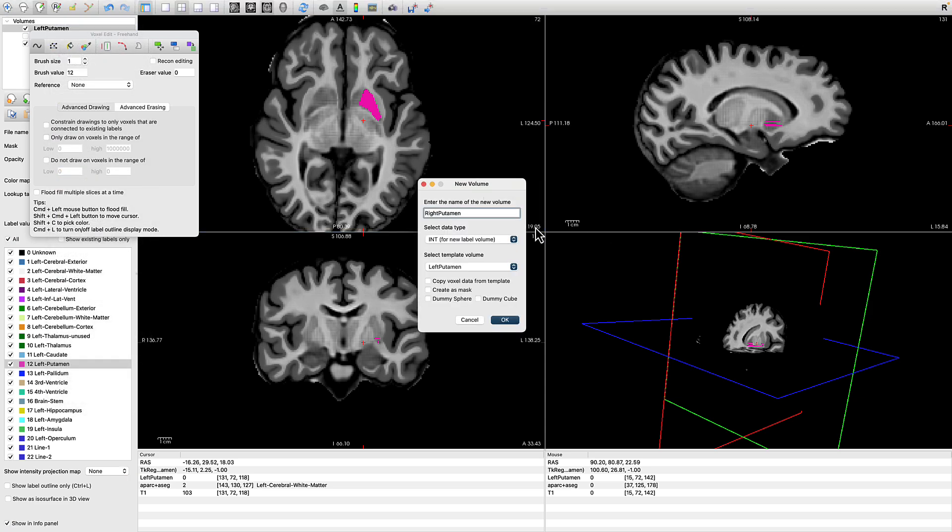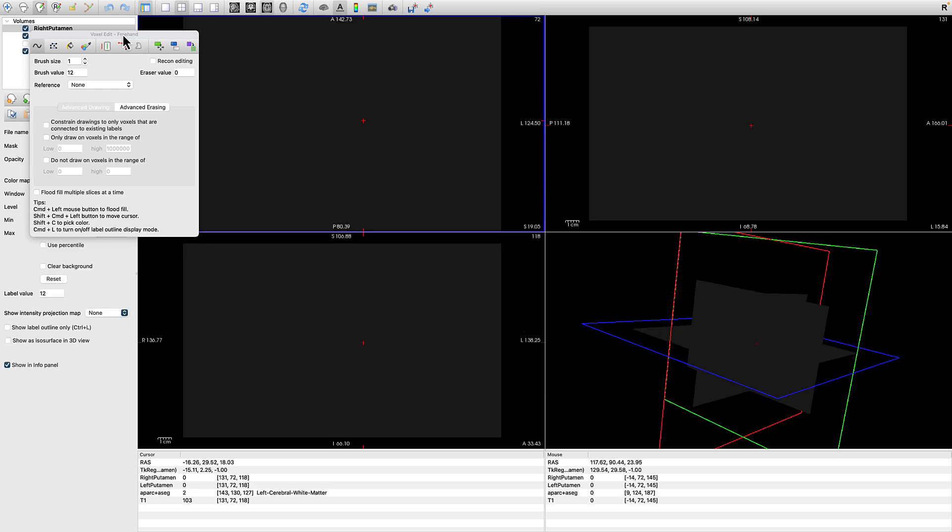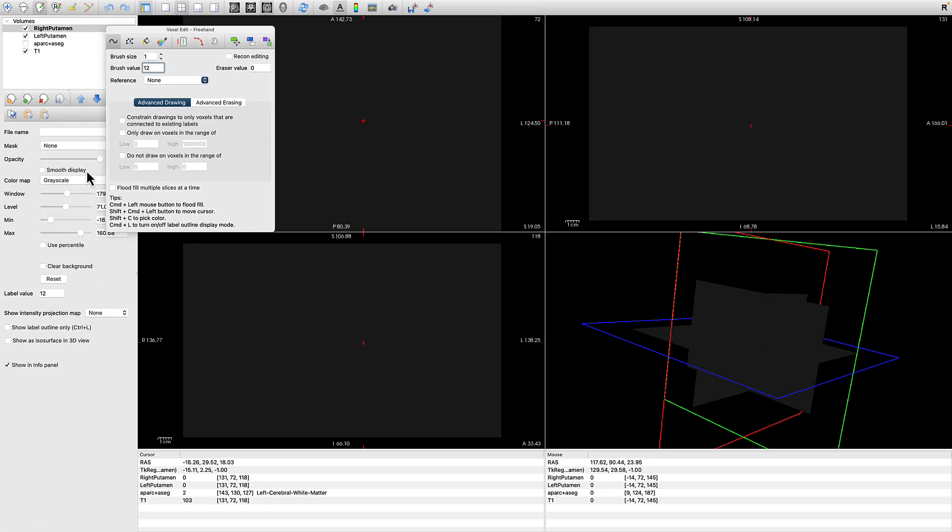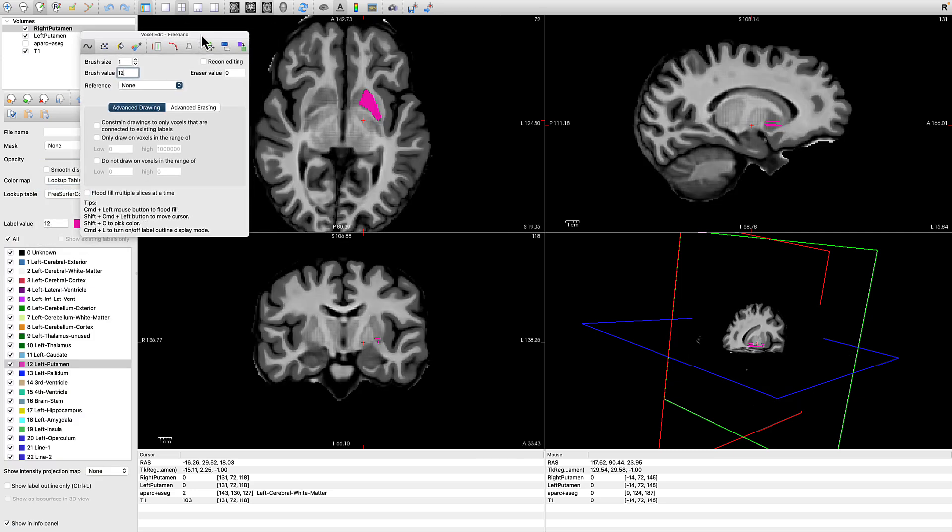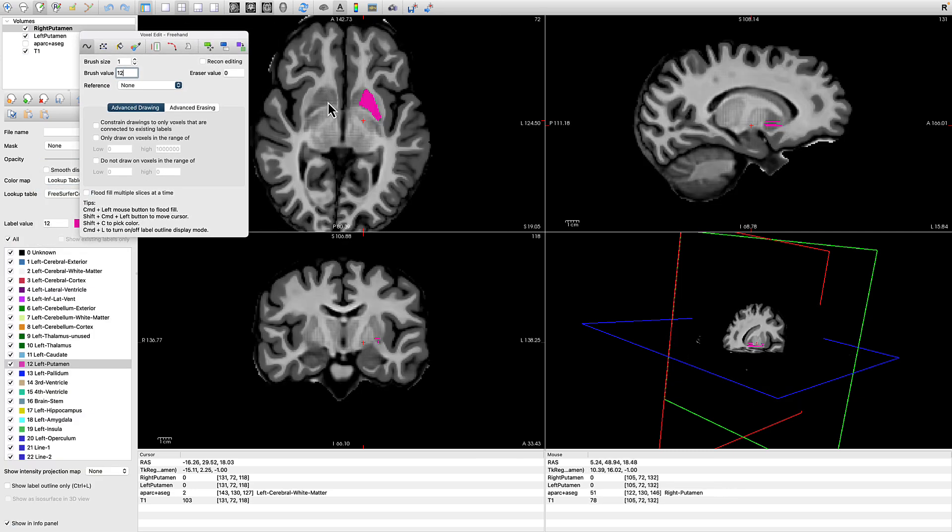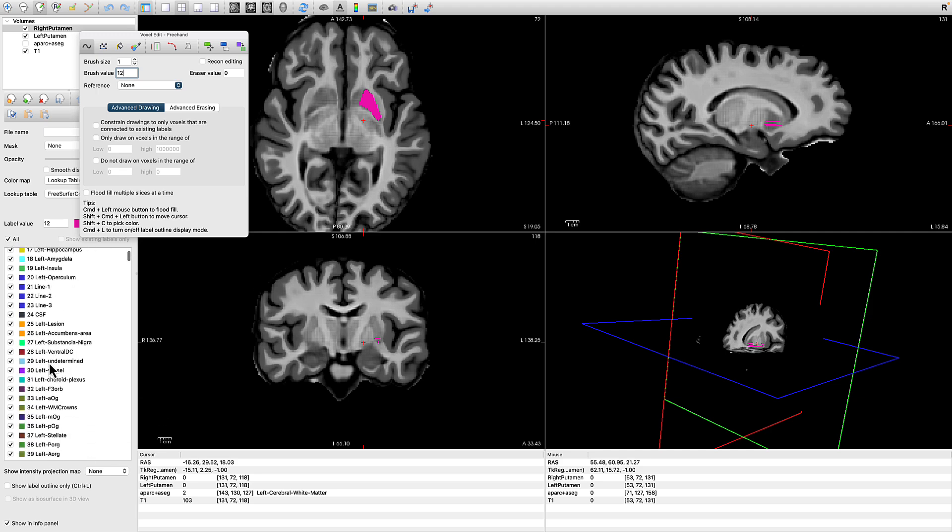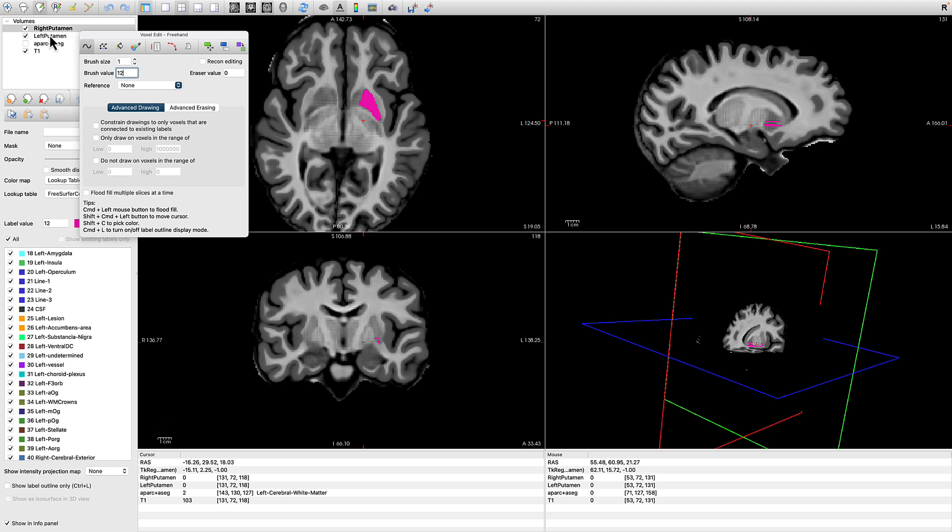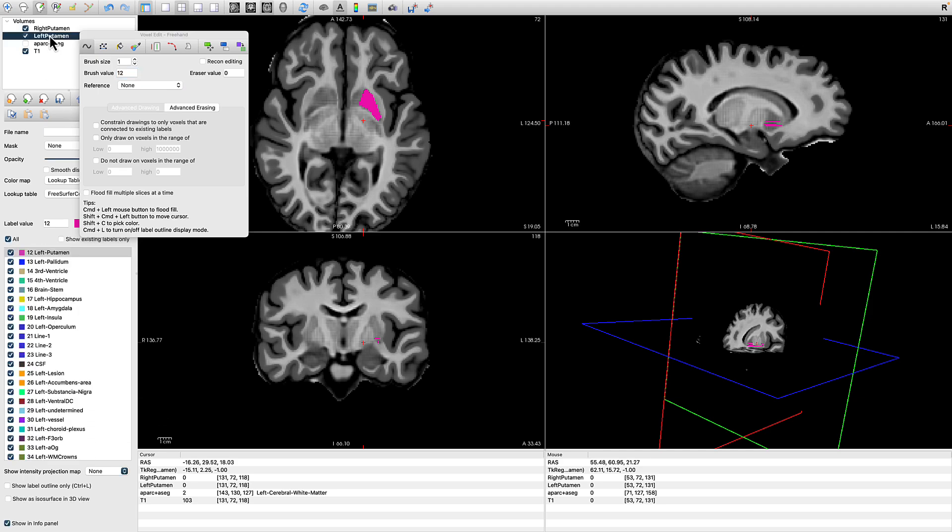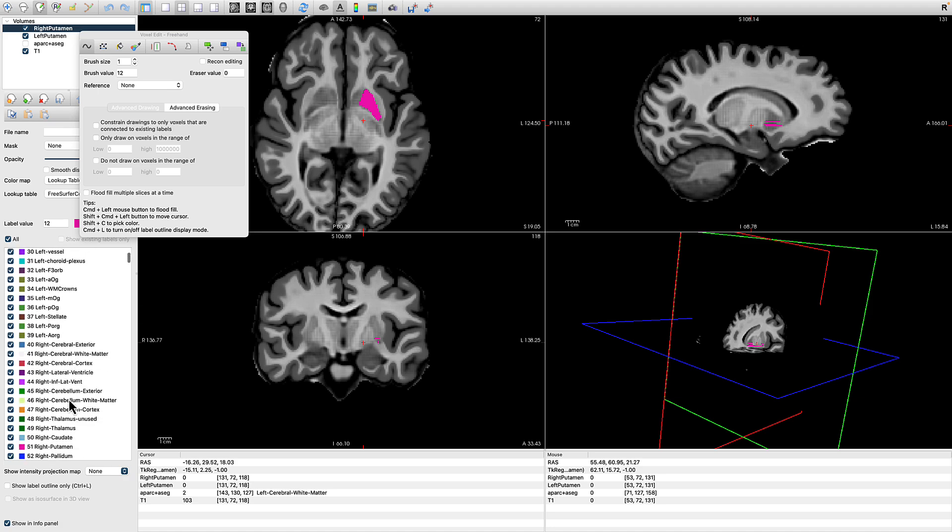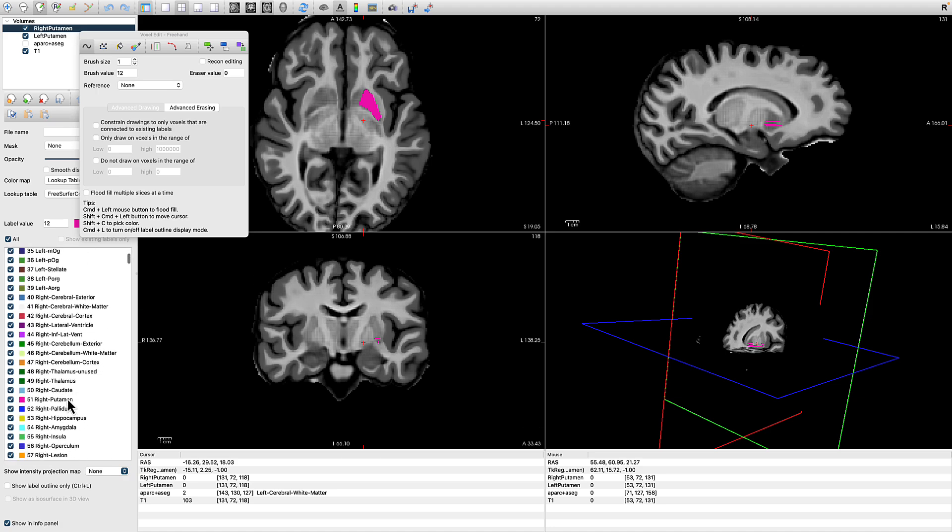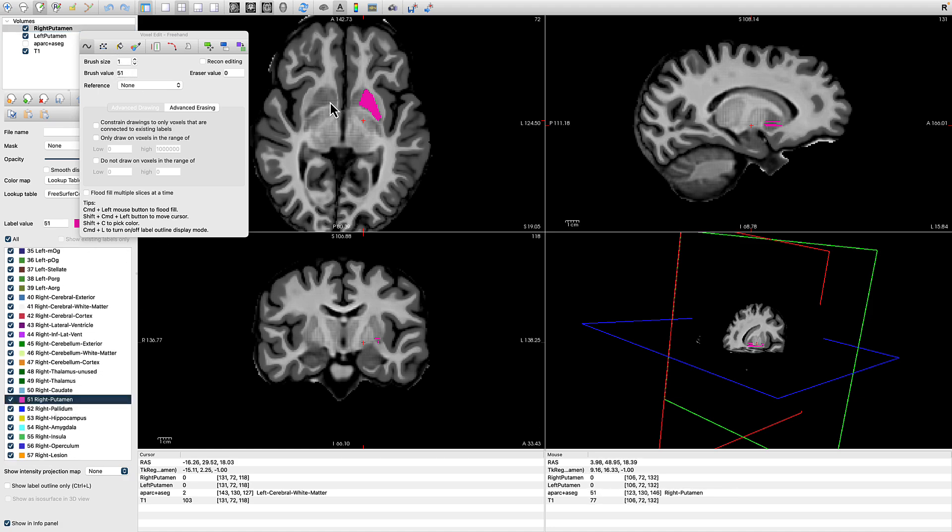At the same time, you can create another structure, let's say the right putamen, with the same default settings that we had before, also using the lookup table. And now we can start filling in the voxels we believe belong to this structure. So it's separate from the left putamen. This is now the right putamen. We can scroll down and highlight that part of the lookup table associated with that structure and start filling it in.